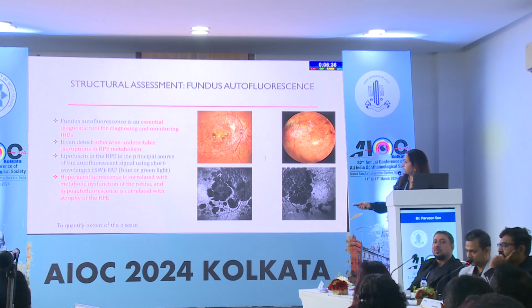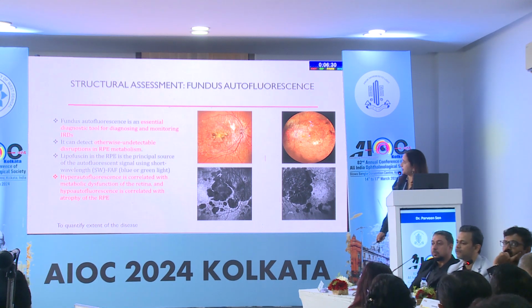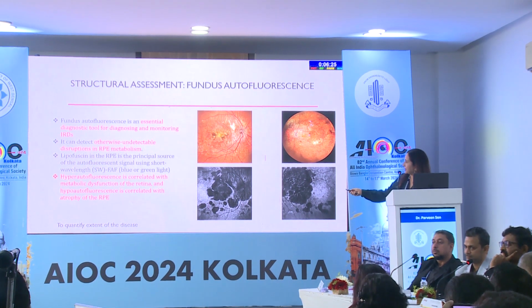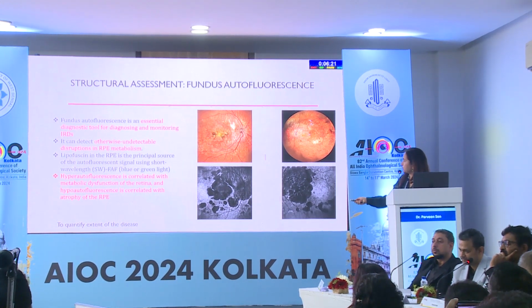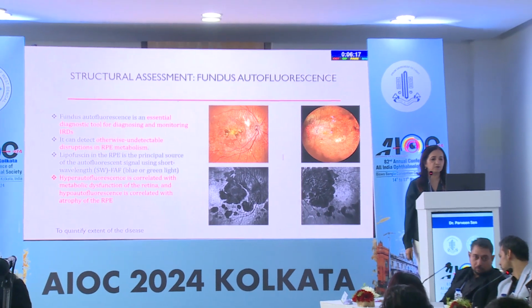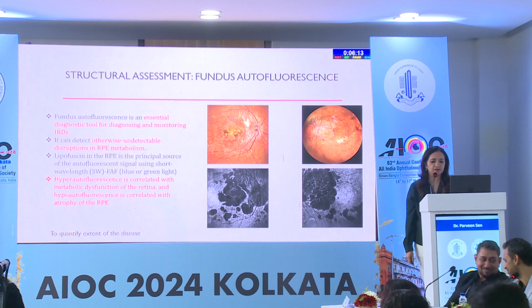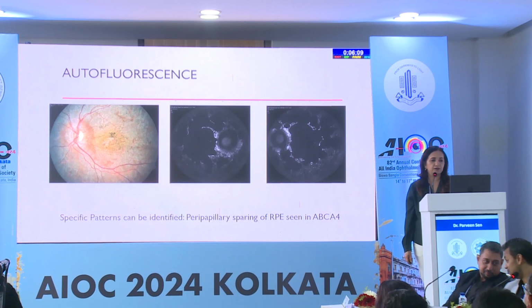Another example of a very good investigation is fundus autofluorescence. Fundus autofluorescence is a must in cases of IRD. You can see the fundus photograph is actually not showing you the extent of disease as beautifully as fundus autofluorescence will show, and this is because we know FAF shows hypoautofluorescence correlated with the death of the cell, and hyperautofluorescence is associated with metabolic dysfunction.